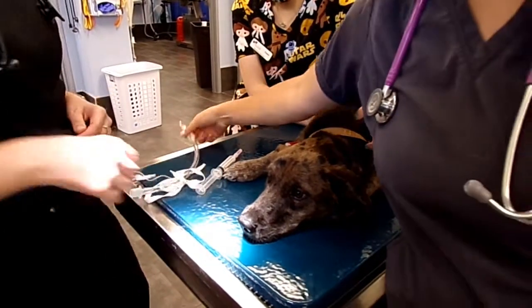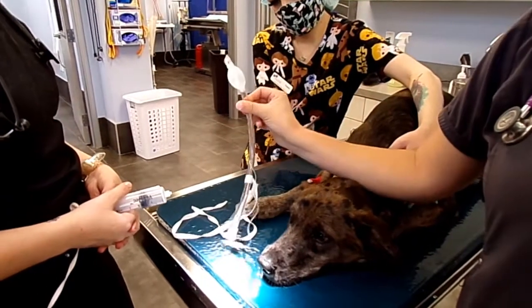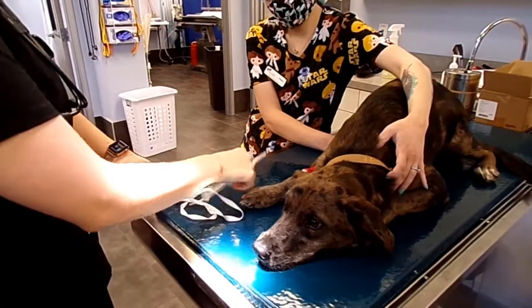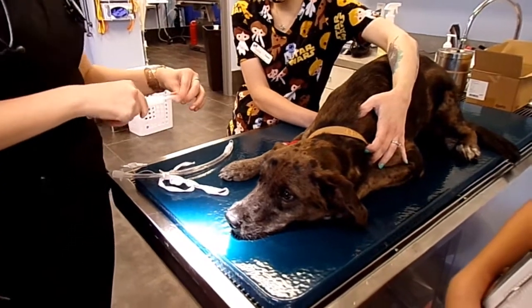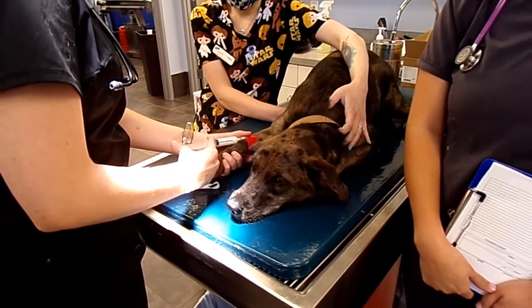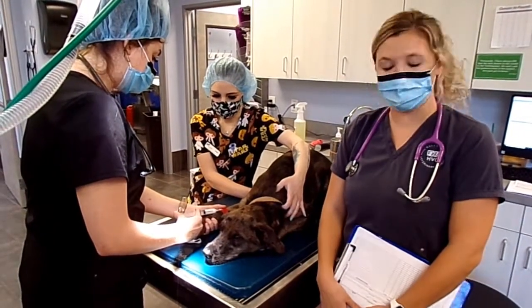We're going to check our tube first — make sure the inflation cuff works. You can see it inflates and it's not deflating, no holes, so that tube is good to go. Now we're giving our propofol. Propofol is important — you don't want to give it too fast. Give it nice and slow, as you see Holly doing here, pushing nice and slow. We'll do about half the amount, wait about 30 seconds to see how we're feeling, and then push more as needed.